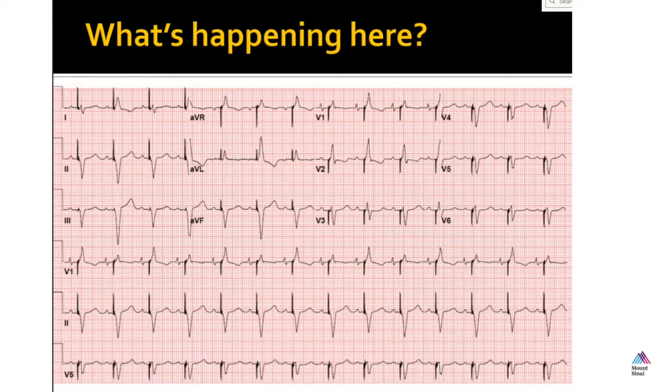And so what happens is, think about where the pacemaker wire in the ventricle is. Let's say, for the sake of discussion, that the wire is towards the apex of the right ventricle. So if somebody has intermittent conduction, and the AV conduction is slow, so you have a longish PR, but it's not awful.